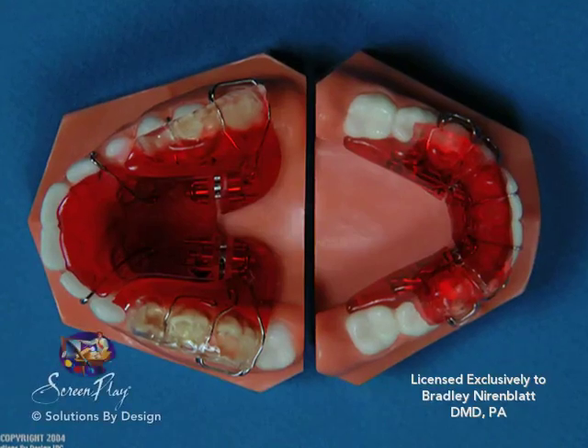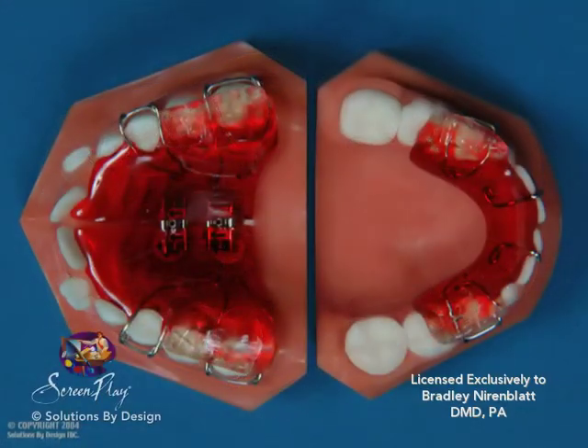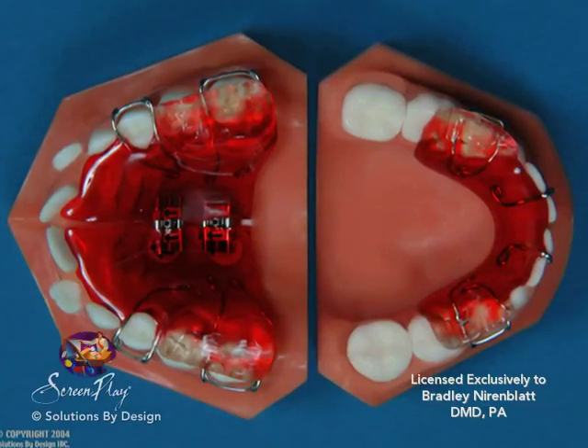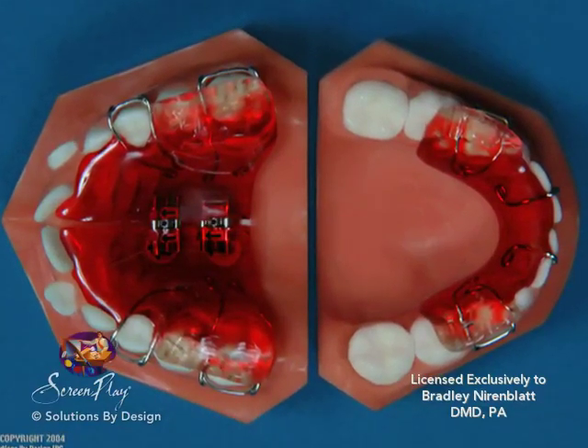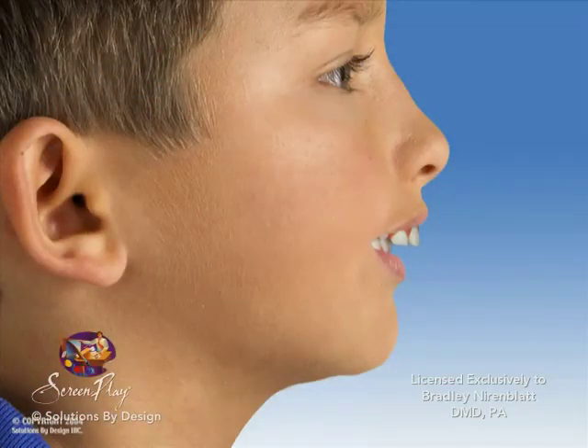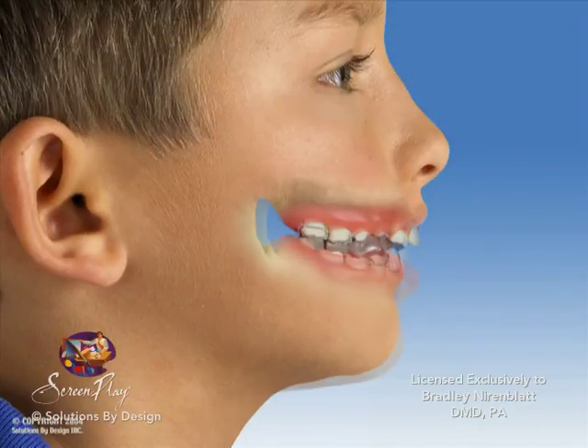Each of these appliances is made up of an upper and lower plate which work together to correct the bite. It is like wearing two appliances that work together — one fits the upper jaw and the other fits the lower jaw. They work together to bring the lower jaw forward.